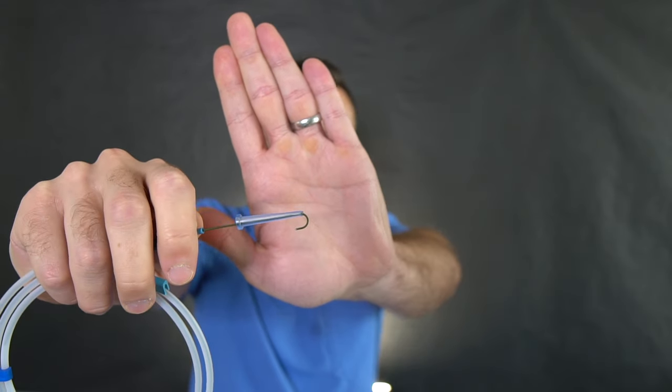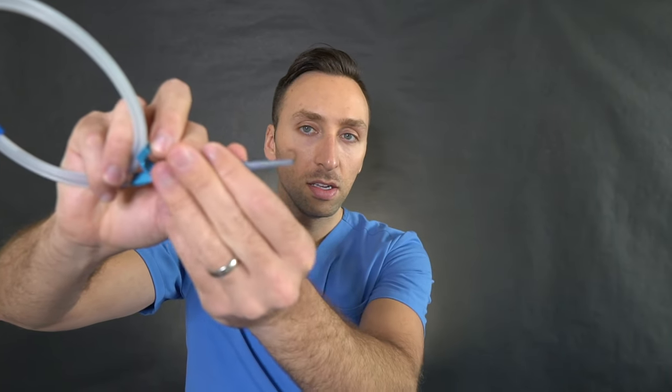You would access the internal jugular vein — I'm not going to do it on myself, but once you gain access with an 18-gauge needle, you can directly place this guidewire. It's a J-wire, and you can see this is our cheater system — you would put this through the needle and thread it down the entire length down to the IVC. So what you would have is basically the wire hanging out of the neck. There are plenty of videos that show the whole procedure being done.